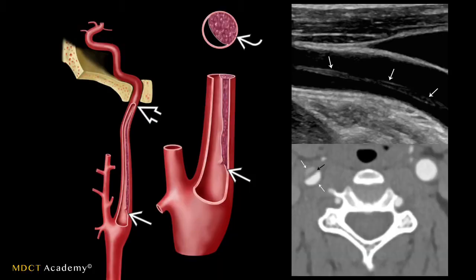This is a typical example of a dissection. The 3D schematic is on the left. On the ultrasound image at top right, you can see the intimal tear — the larger area is the true lumen and the smaller area is the false lumen. On the CTA below, contrast fills the true lumen while the false lumen shows very slow filling. Importantly, contrast mixing can be misleading. To distinguish true from false lumen: if the angle between the lumen and vessel wall is less than 90 degrees, that is the false lumen; if greater than 90 degrees, it is the true lumen.